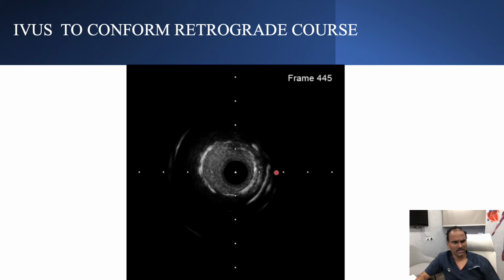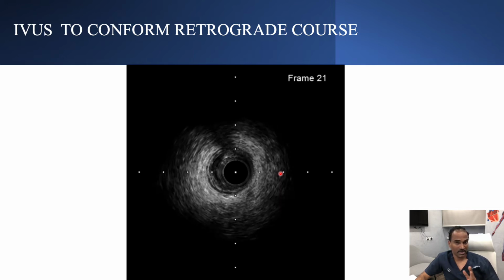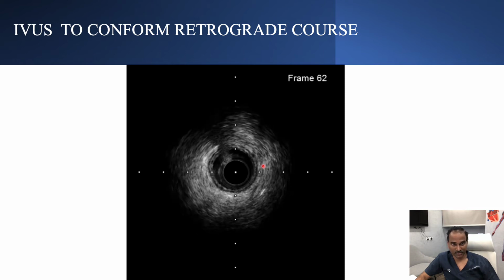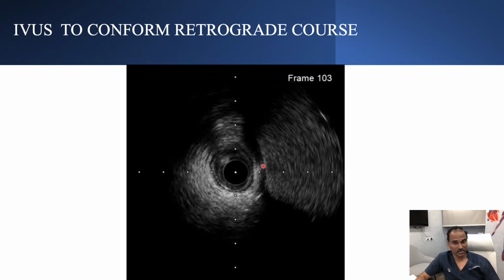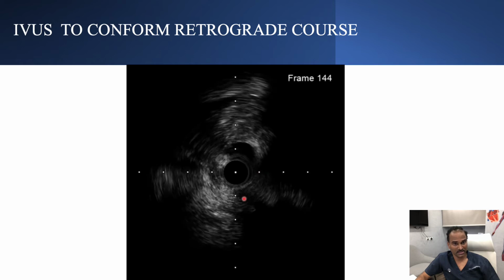So it's a kind of retrograde plaque as well as flap shift, which will happen. Once you confirm this position, then you can move on to your next step of externalization.